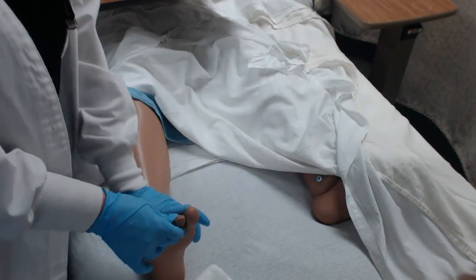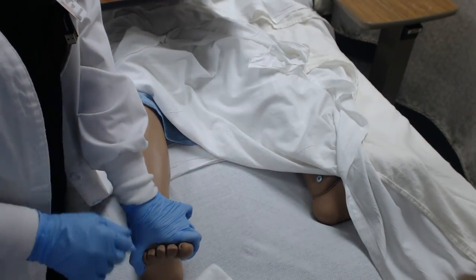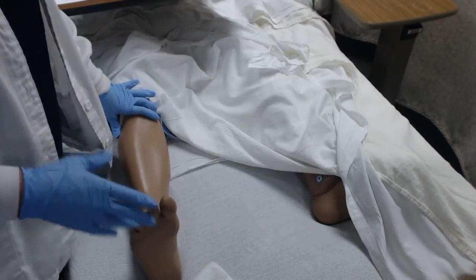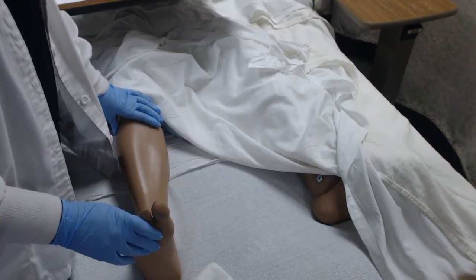I also want to do capillary refill, so I would go ahead and push down on the toe bed, looking for that refill within 3 seconds. So that's first and foremost. You can't do a proper reassessment of the TEDs if you don't do an initial assessment.